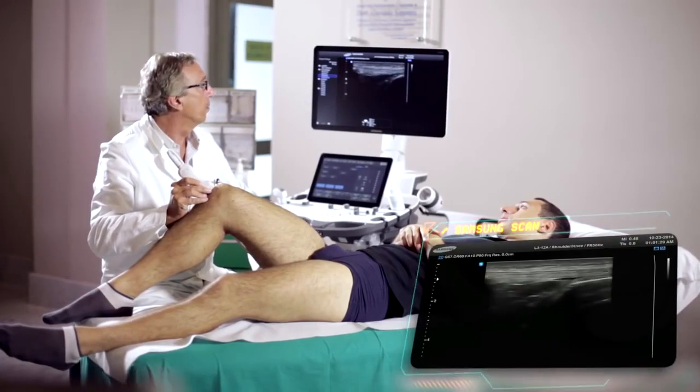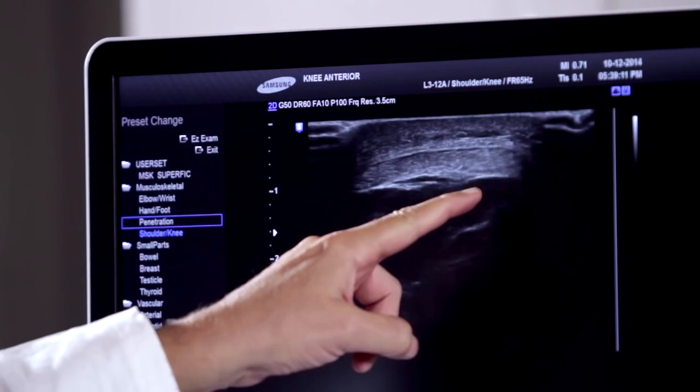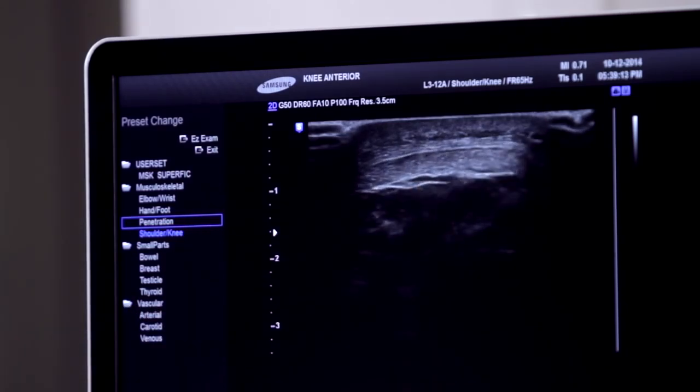It is a tendon that has a thin morphology, so thin that when we do the scans internally, rotating the transducer clockwise by 90 degrees, we can see its classic thin morphology with a concave ventral profile, which is a feature of this tendon.